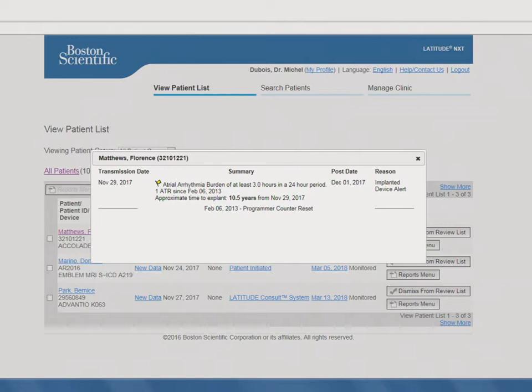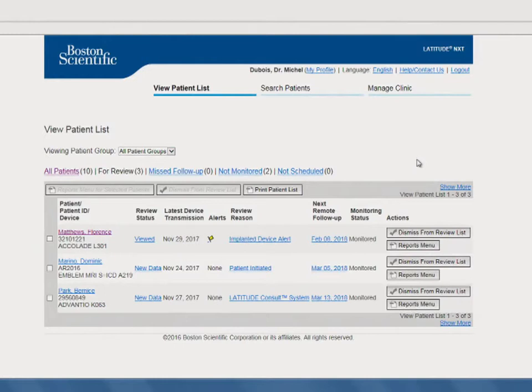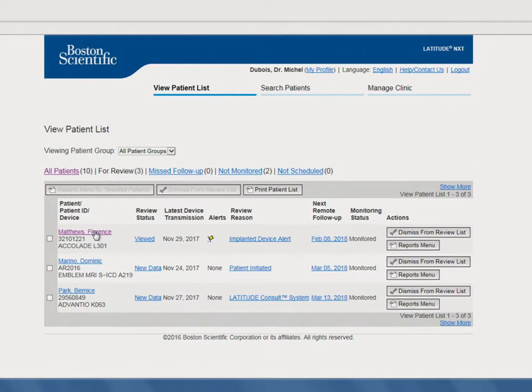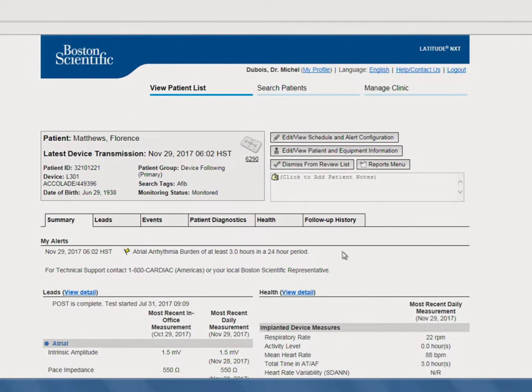The final way is from the Individual Patient's page. From the View Patient List, simply click on the name of the patient whose information you want to review. Within the My Alerts section, you'll see detected alert information. The type of information shown here is similar to the basic information you saw in the alert pop-up window. These are three convenient options for you to quickly access your patient's detected alert information from within Latitude Next.